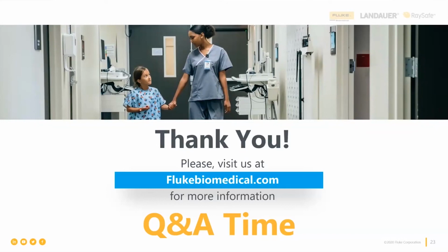If you follow the standards exactly as to what they say, they are going to have you test the output energy at each and every possible setting. But then they're going to have you do 10 discharges on battery at the maximum energy delivery setting, the 10th one of which you're going to measure a charge time. It's called the charge time test. It's described more in a different training that we have. It's a test to evaluate not only the battery, but the capacitors, the other parts of the charging circuits and so forth, to make sure that after that 10th battery discharge at maximum energy setting, it's still going to deliver the full amount of energy that it's supposed to.